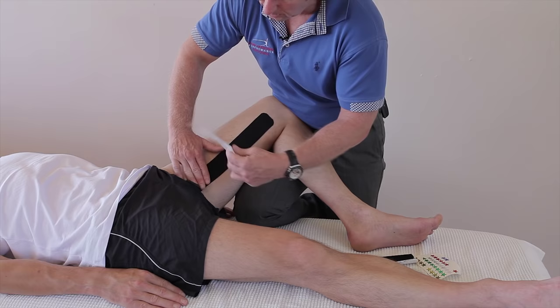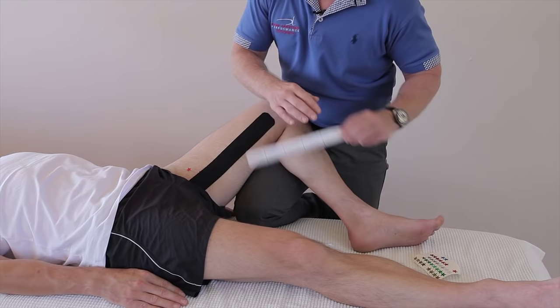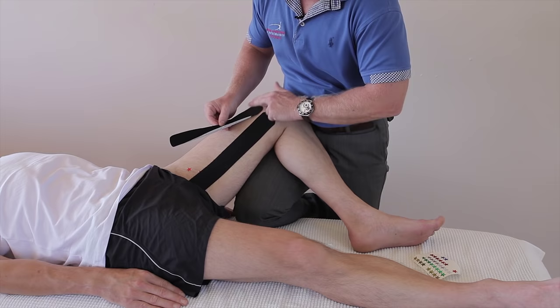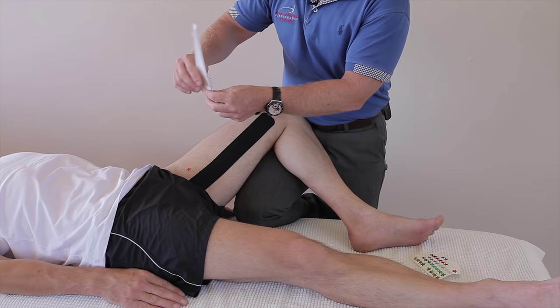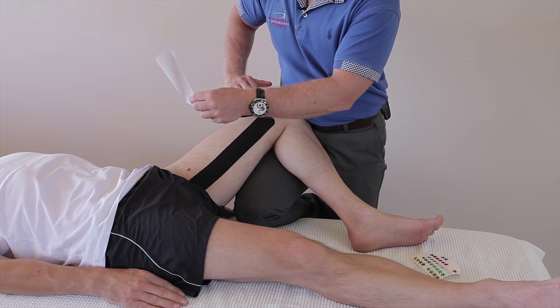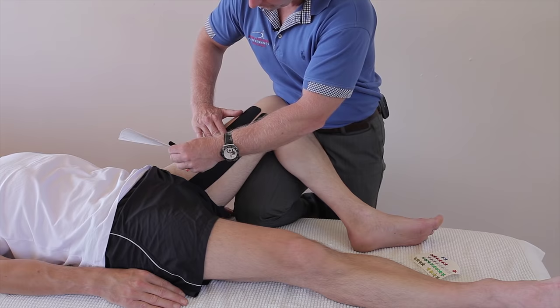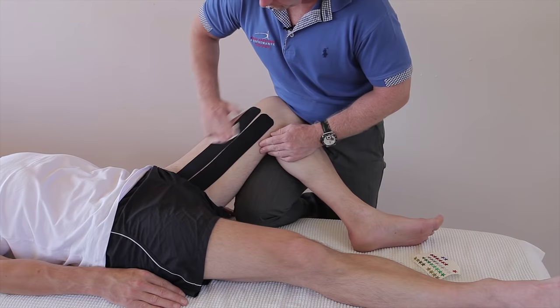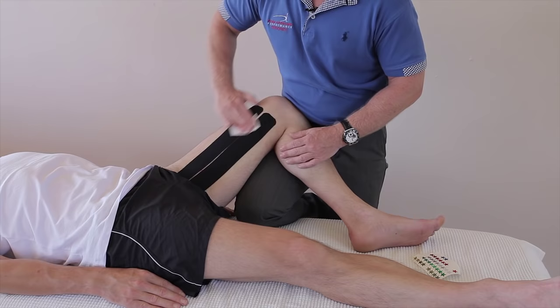For the second one, I peel back the first square and apply the tape almost next to the first tape, because there are five major adductors so we're trying to offload the whole adductor group. From there, with little to no stretch — I tend to leave a slight gap — and that's just going to cross under like so. Then using the back of the tape to warm up the glue so it becomes a bit more adhesive. There we have kinesiology tape in for the adductor muscle group.